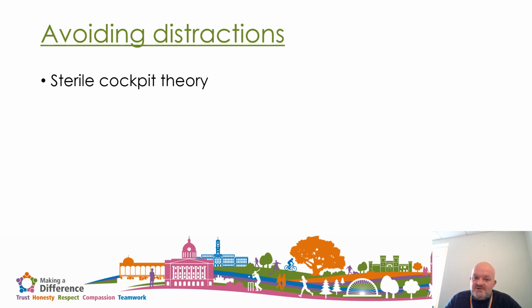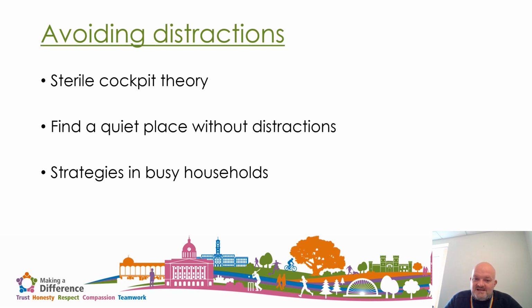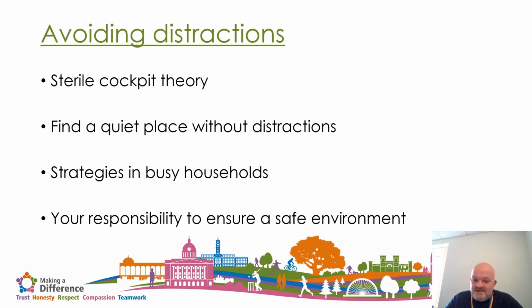And I think that's a really good practice to take with things like syringe drivers, so that when you're setting up a syringe driver, you are fully concentrating on what you're doing with it. As I say, the ideal situation is that you can go into another room, whether it be a spare room, spare bedroom, or a kitchen, and set up the syringe driver without any distractions. Obviously, in busy households you'll need your own strategy, but actually it is your responsibility to ensure that you are working within a safe environment, both for yourself and for the patient.